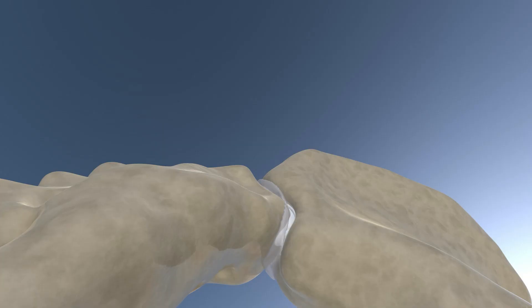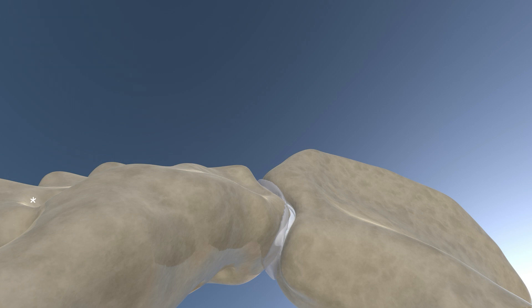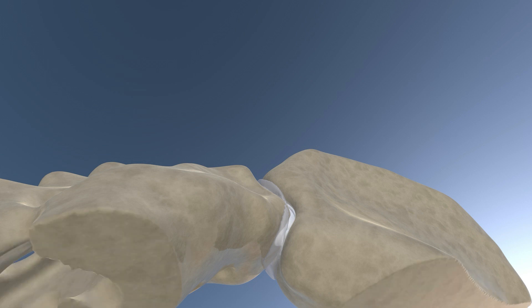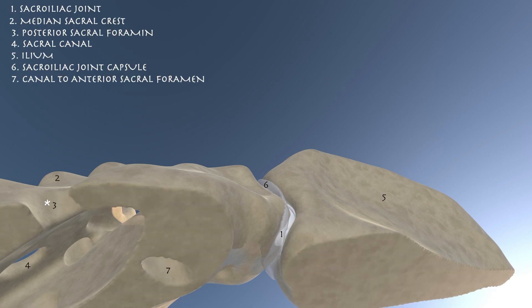Here we're focusing on sacroiliac joint cross-sectional anatomy. We can see the median sacral crest, the posterior sacral foramen, and going laterally, the sacroiliac joint itself. Now doing cross-sectional views cutting through the ilium and the sacrum, you can see the posterior sacral foramen opening up. You can also appreciate the sacral canal and the connection between the anterior sacral foramen and the posterior sacral foramen.